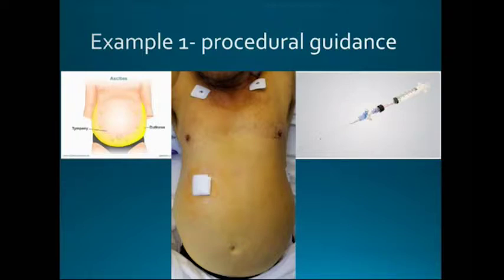And so you say, well, do I need an ultrasound machine to do a tap? You try to think, well, I'm just going to go down around in here. You see that somebody before you has gone up in here. Maybe you go to the same place where somebody else has had success. The same spot over and over again seems to be working. And most of the time, that's fine because the incidence of paracentesis complications is relatively low. And with an abdomen that looks like this, you're probably not going to run into too much trouble.